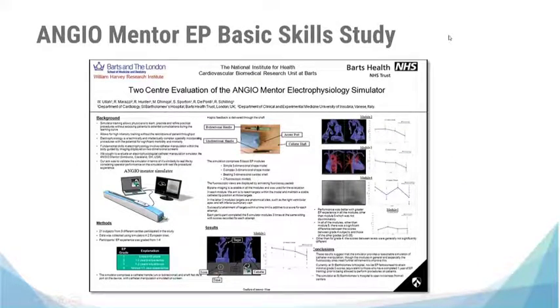Then this is another proof of concept we did in 2 centers together with Richard Schilling and Wajid Hussain in London. We used the Angiomentor electrophysiology simulator. And again, as you will see afterwards, this simulator has 5 modules in which you can practice maneuvering catheters, both diagnostic and steerable catheters, inside the heart, a 3-dimensional cast of the heart, or fluoroscopy image of the heart.